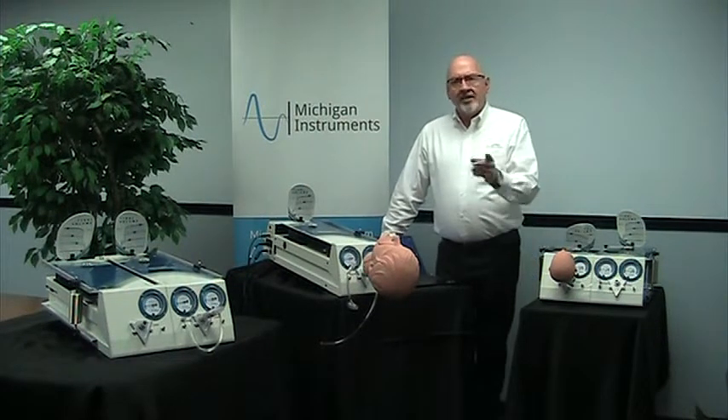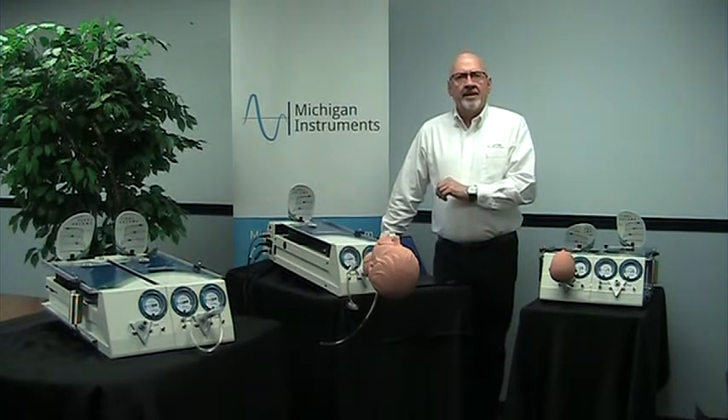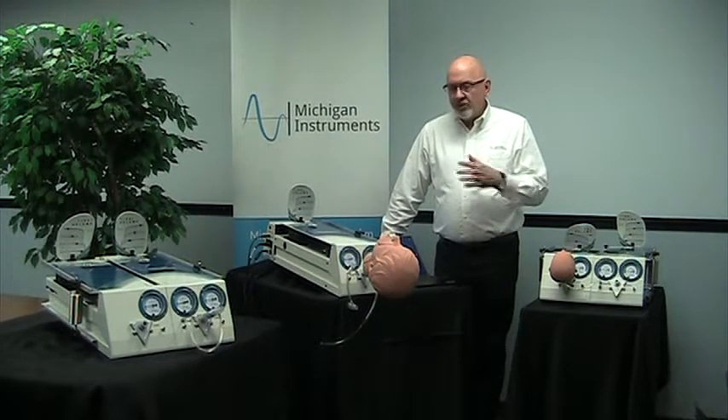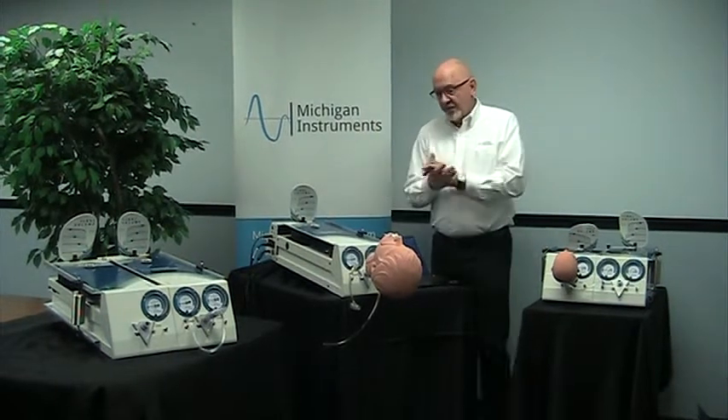Hello, today we want to give a little further introduction into our SBL spontaneous breathing lung system. You may have seen the introductory video at our website and we're just going to expound on that a little bit and answer some of the questions that we're getting about this system that we offer.